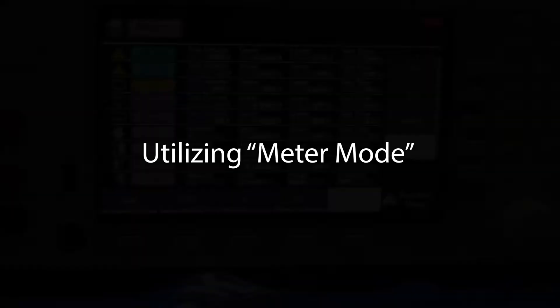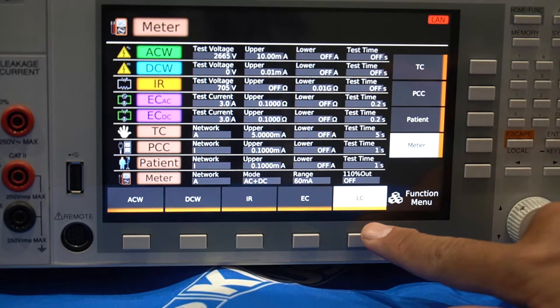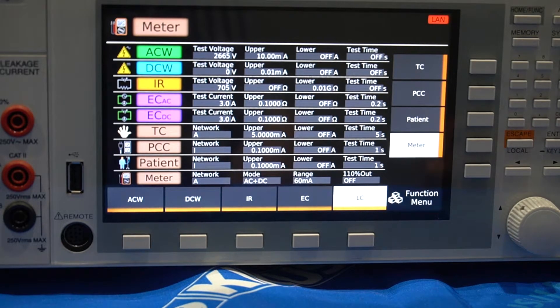Another application we will show you is how to measure touch current when you have an EUT capacity that exceeds 1500 VA or has three-phase input. You will be able to conduct the touch current test by utilizing the meter mode. First, select LC, then choose meter mode, then repeat the same selection process.